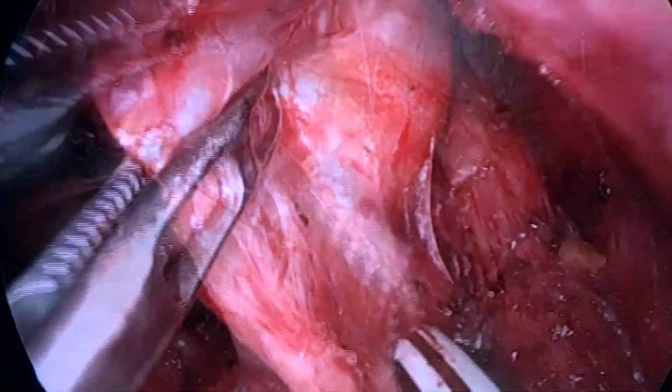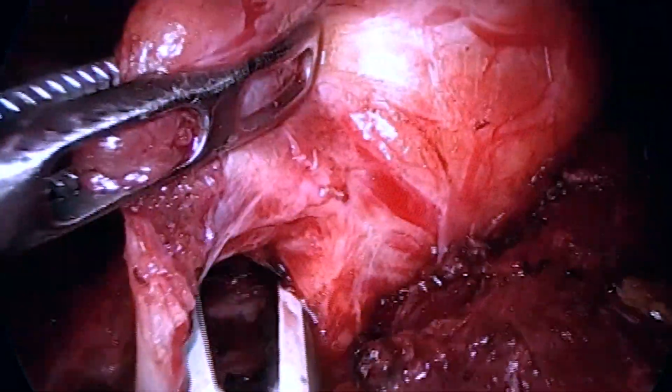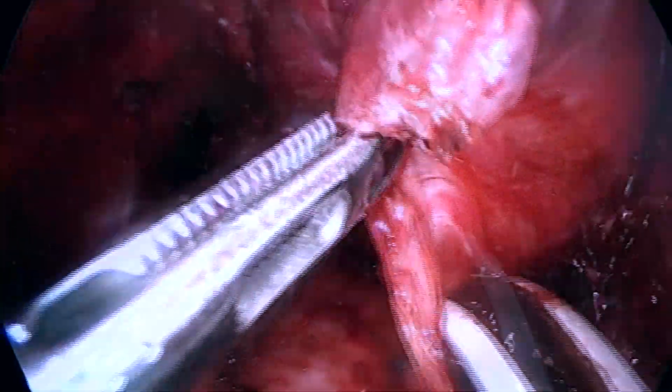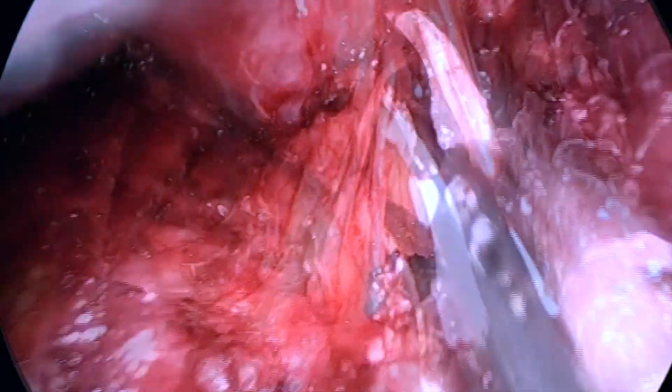Once the recurrent laryngeal nerve is identified, a true intracapsular dissection of the thyroid gland is then proceeded from a cranial to caudal direction, taking care of the supply to the parathyroid glands.